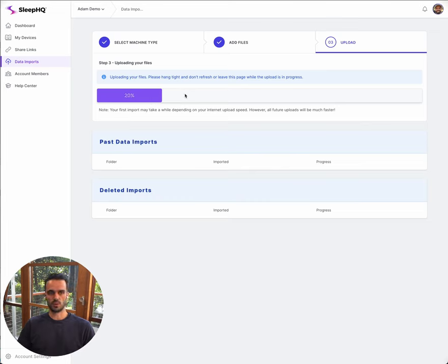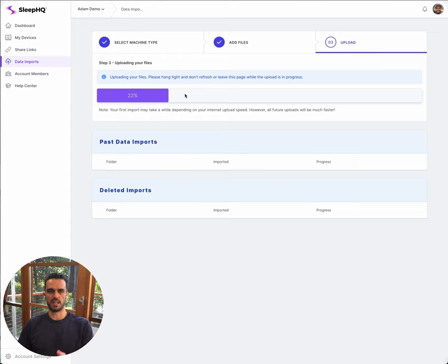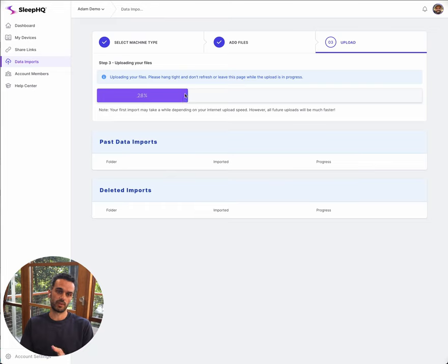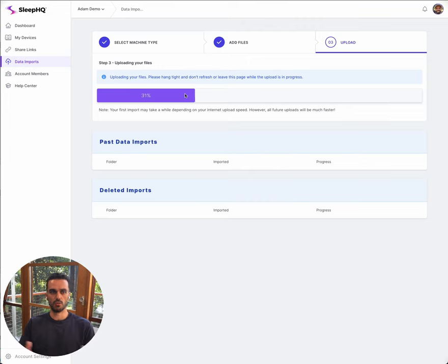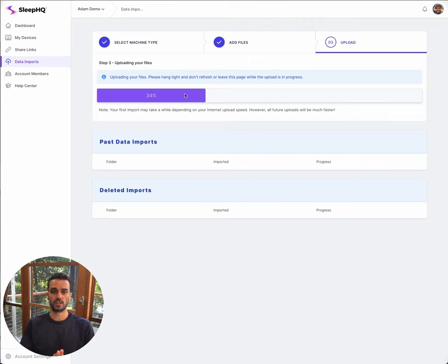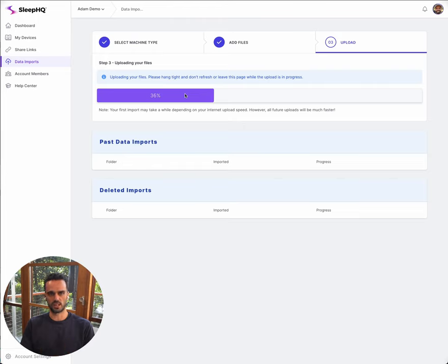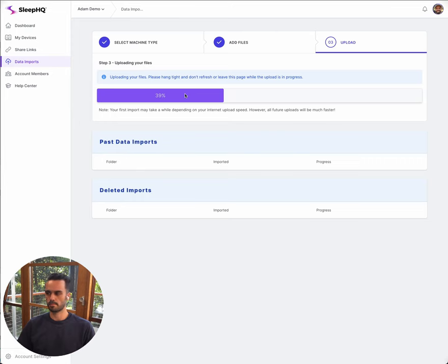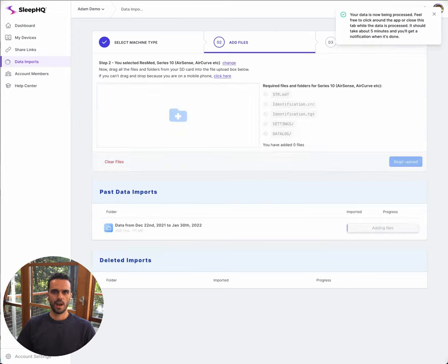Drag in your entire SD card every time and what you'll notice is that this window will progress much, much faster. It's going to jump up to say 80, 90, 95 percent because it's only going to actually upload anything that's new or files that have changed since the last time you did an upload. So really easy, just drag in everything off your SD card. It'll make sure that you don't ever miss any files or folders. The system will always just check to see if you've already uploaded that file. If it has, it just gets checked off automatically.